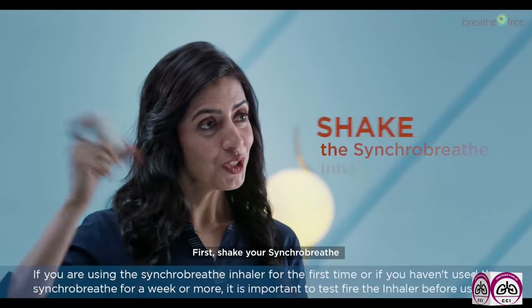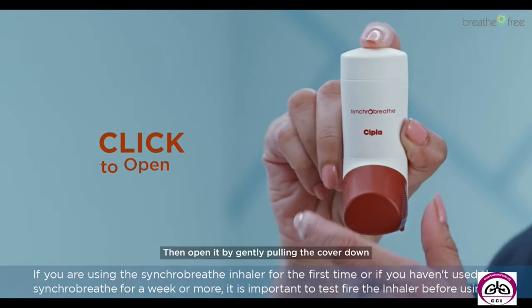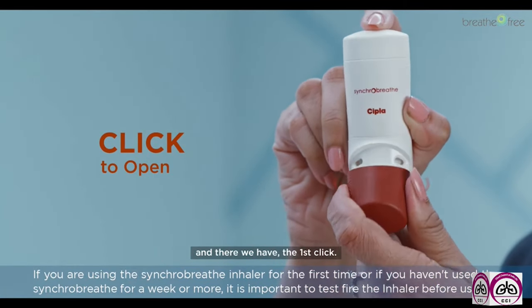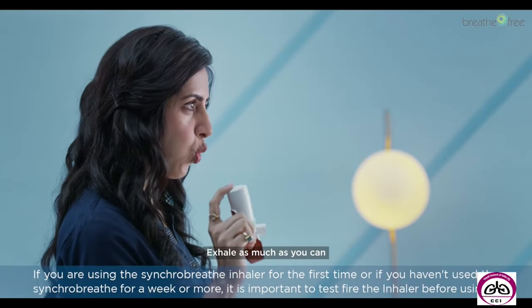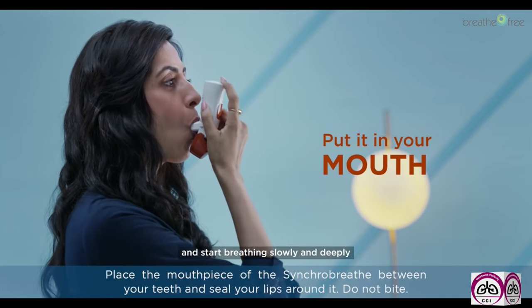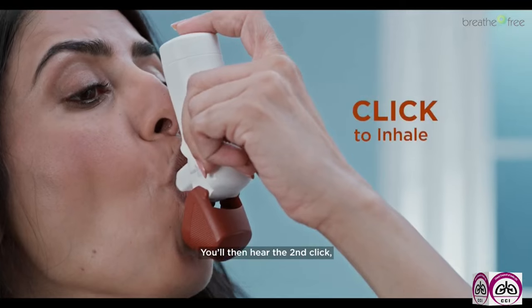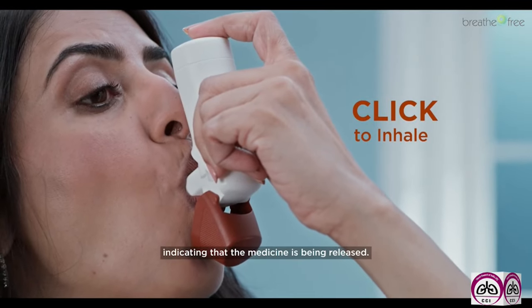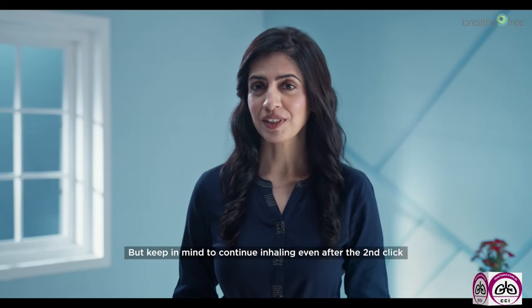First, shake your SynchroBreathe, keeping the mouthpiece cover closed. Then open it by gently pulling the cover down. And there we have the first click. Exhale as much as you can before you put the SynchroBreathe in your mouth and start breathing slowly and deeply through the mouthpiece. You'll then hear the second click, indicating that the medicine is being released. But keep in mind to continue inhaling even after the second click.